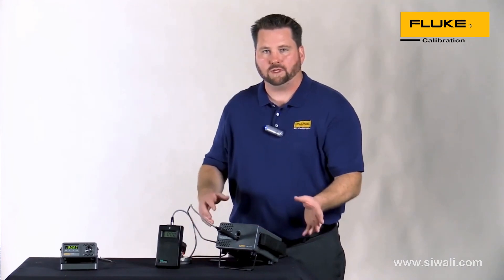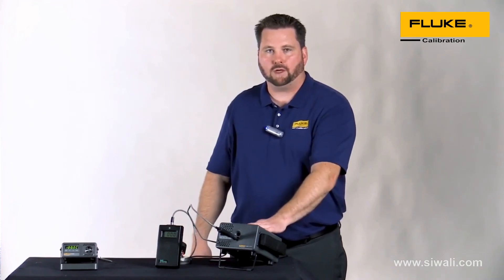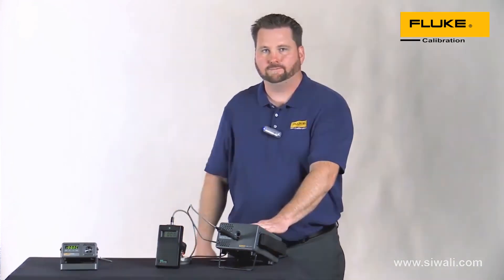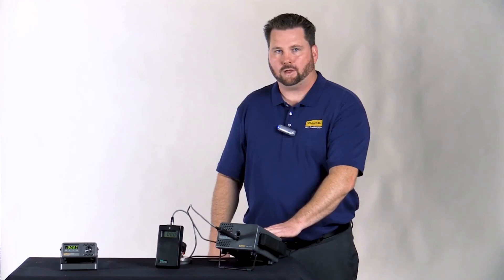You can see the difference between using the water technique versus a dry well. The big benefit here is you're working with a known uncertainty versus an unknown. To learn more about our dry wells and how they can help you improve your sensor measurements, please visit us at www.flukecal.com.